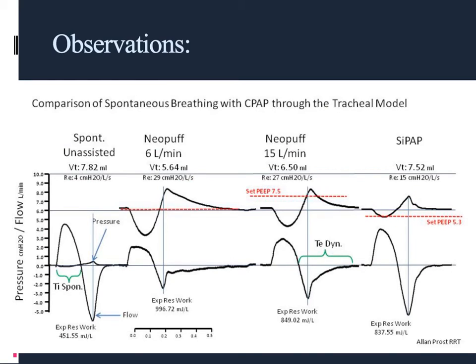And you'll notice I'm also getting very, very high expiratory flows. So the work of breathing on exhalation is also dramatically reduced. So the CPAP ventilator looks like a really good choice to deliver CPAP for my neonatal patients.